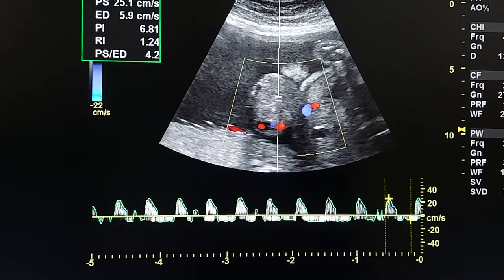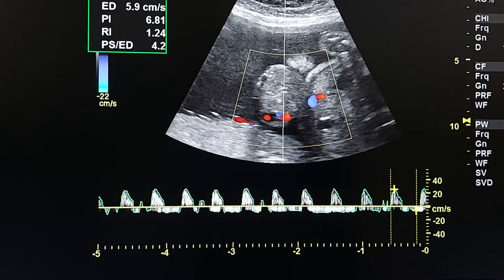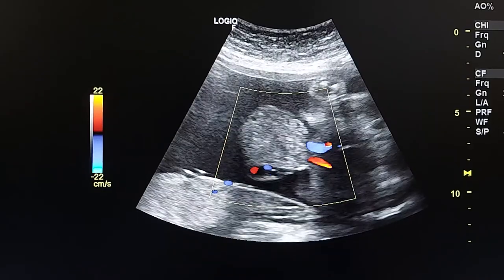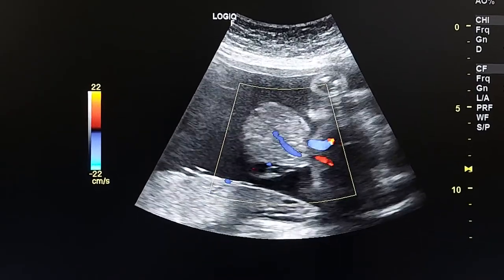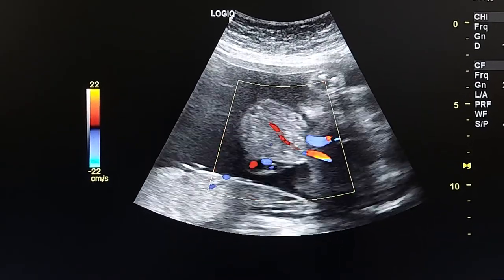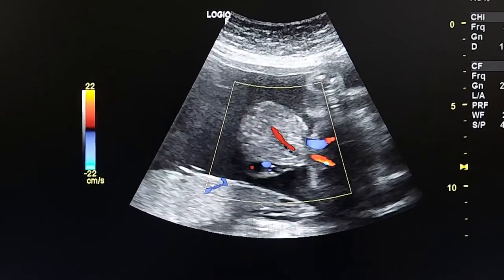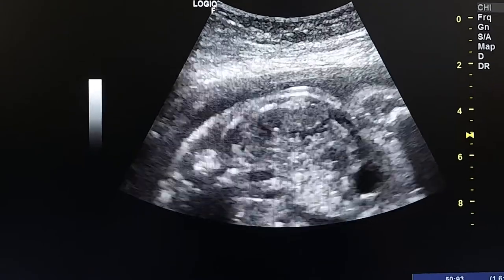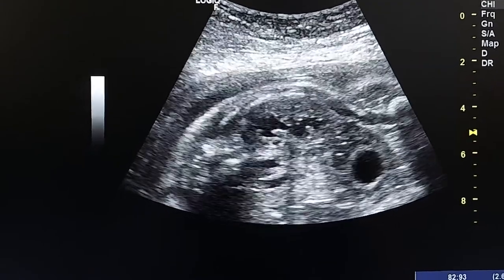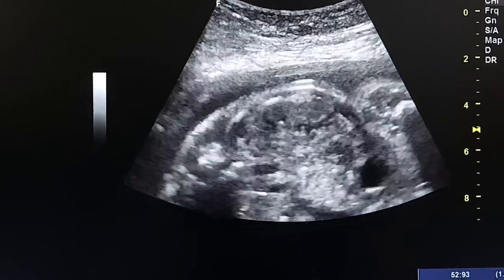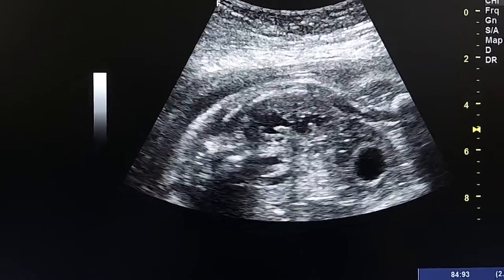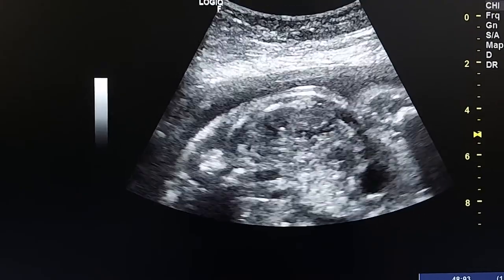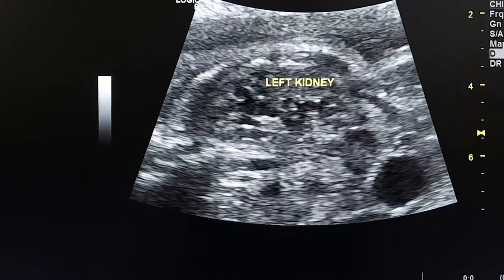This is the spectral Doppler of the central artery on this lesion. Also noted are dilated — mildly dilated — kidneys.